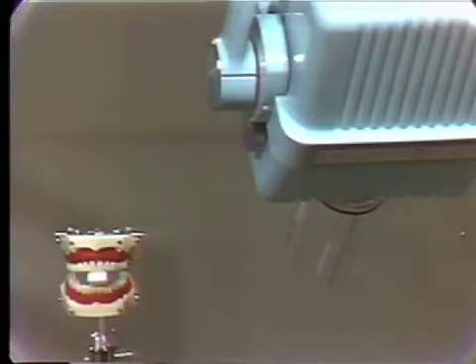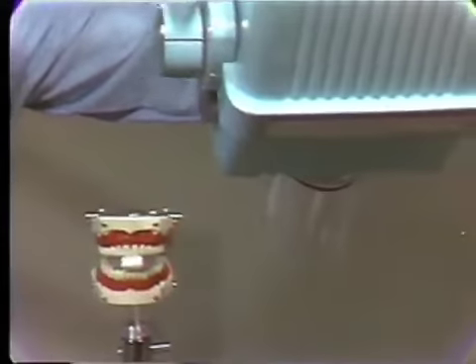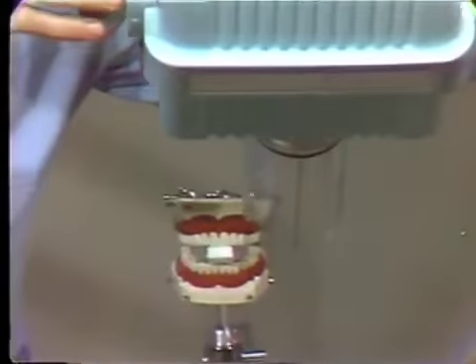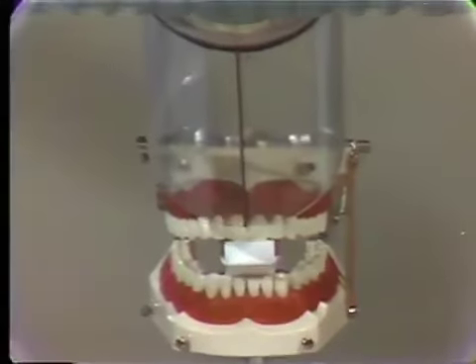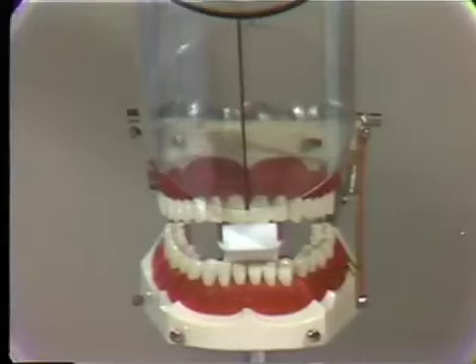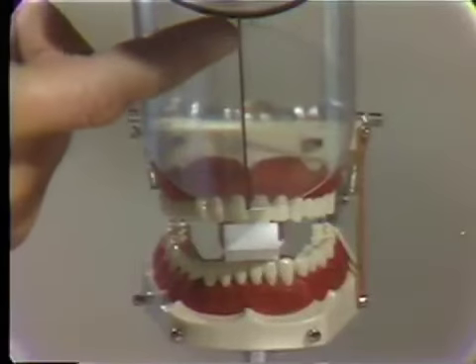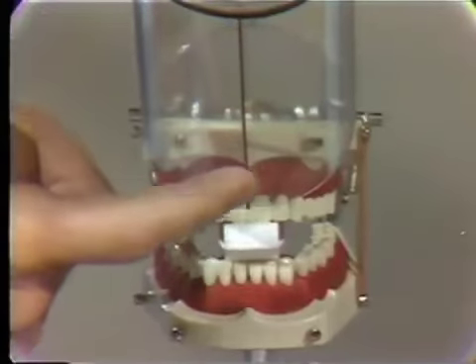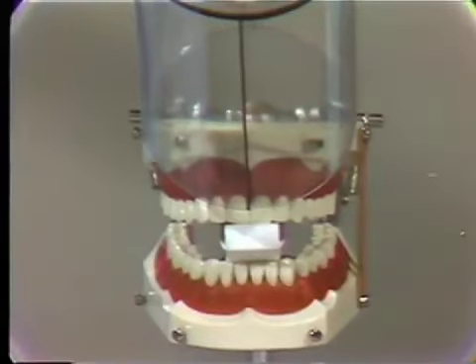Now the next step in the procedure is to determine the horizontal angulation. Now I'm going to bring the X-ray machine into position so the path of the central ray indicated by this black line will be oriented in the same direction that I am looking. I want to see between his two centrals, and so that's exactly where this line is pointing, in the same direction I am looking. So the rays will open this contact between the mesial surfaces of the centrals.